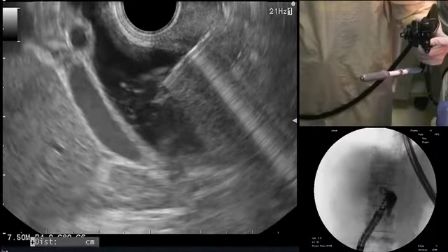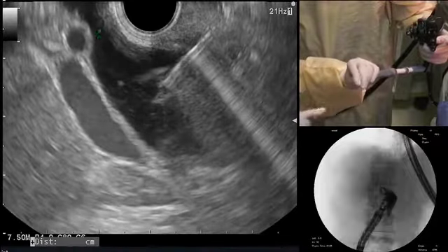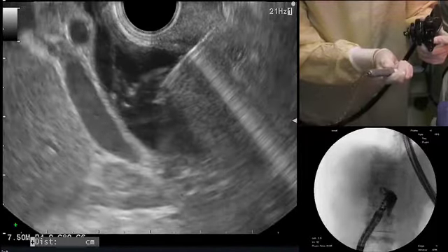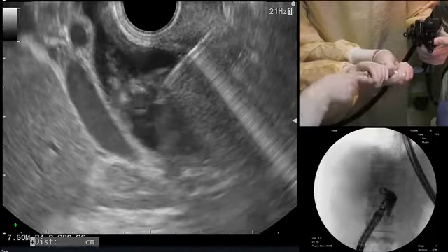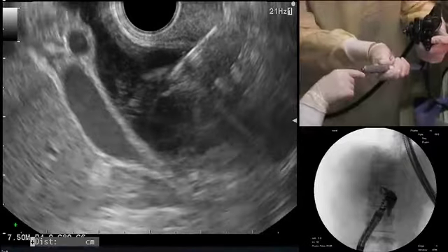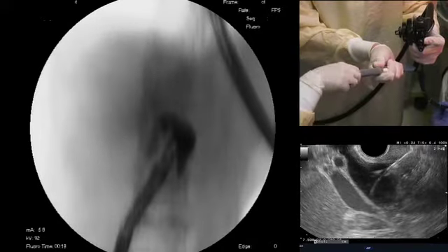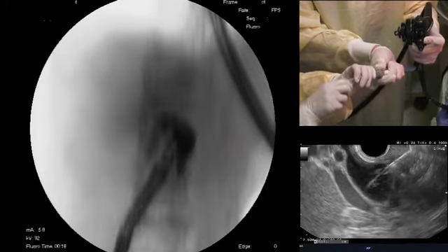In terms of the anatomy, we have the portal vein, the hepatic artery, and the bile duct here — and this is possibly even the takeoff of the cystic duct as we saw earlier. What we want to make sure of is that our wire is going up into the common hepatic duct and not into the cystic duct, so that's why we are using fluoroscopy. Here's our wire coming in — the wire is actually going downstream, the wrong direction. We want it to go upstream.